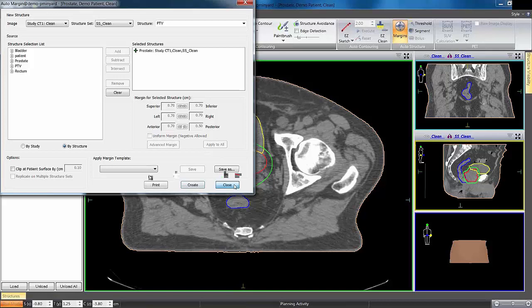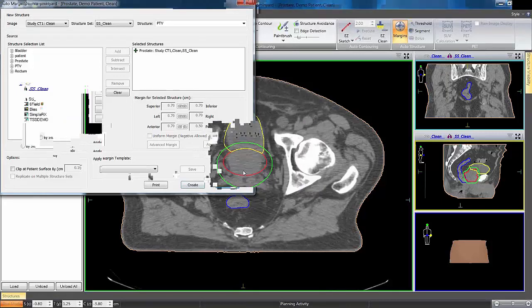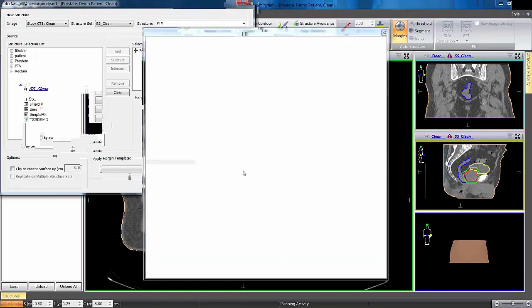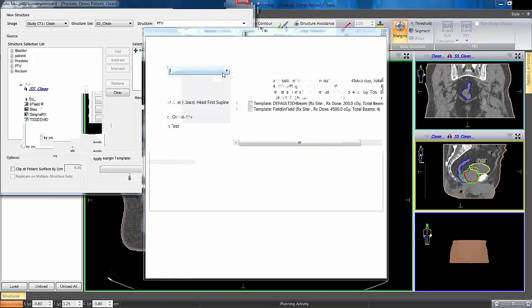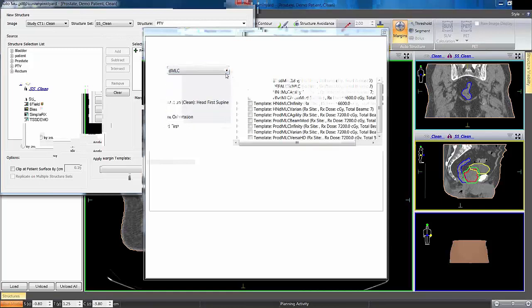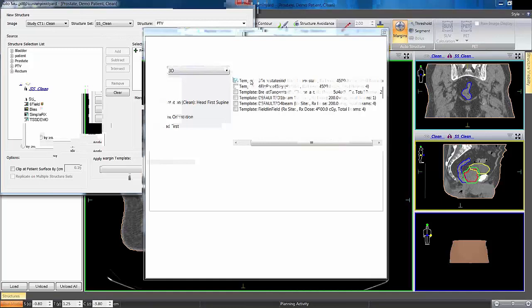From here I can move right into planning. I come back to my CT set, right-click, and say New Monaco Plan. Everything in Monaco is template-based, so we start with a template. All the templates are organized by delivery mode—I've got a number under 3D, DMLC, VMAT, and so on. These are templates you create for your clinic based on criteria you tend to use. I'm going to start by picking a simple 3D prostate.